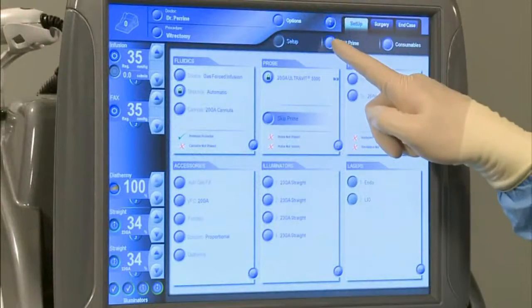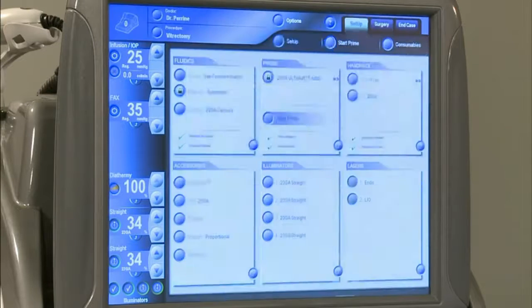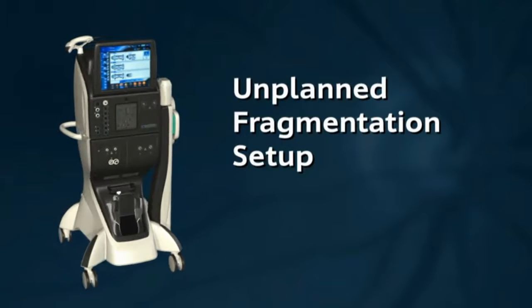Initiate prime in the setup screen. The fragmentation handpiece will be primed and tuned as part of the priming and tuning sequence. After priming and tuning is complete, the system will automatically proceed to the surgery mode. Fragmentation is now ready. This next method describes the unplanned fragmentation setup.